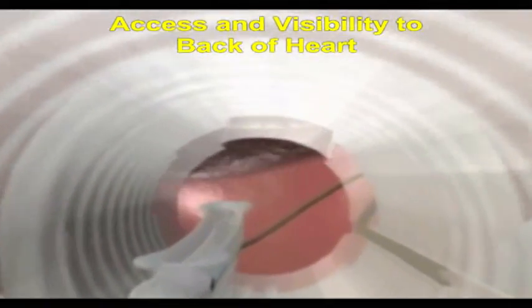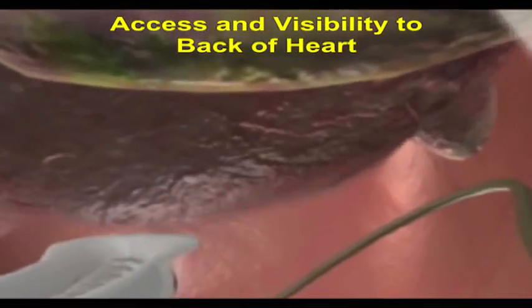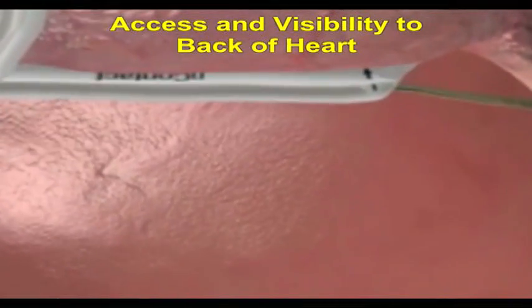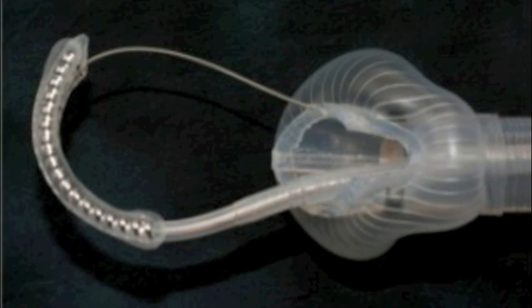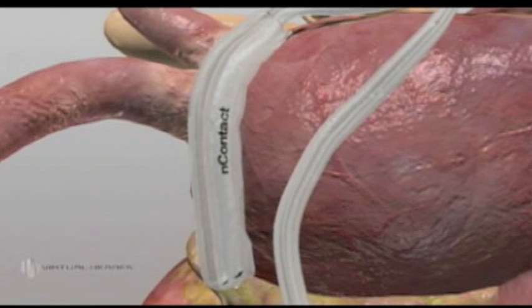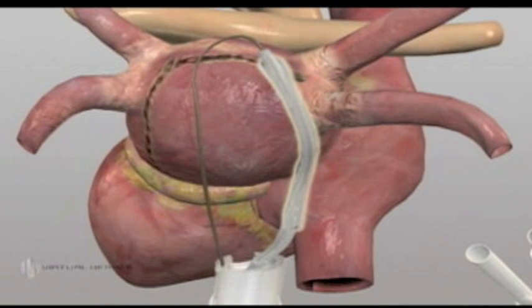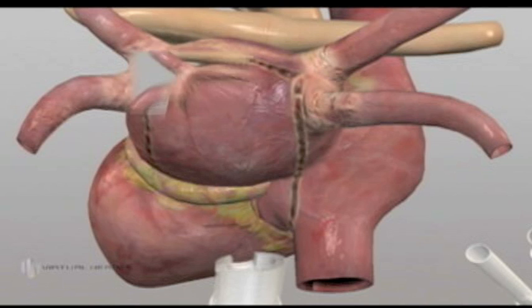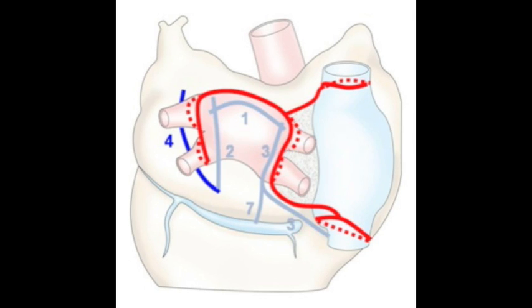The procedure is performed with direct visualization of the beating heart. The specialized electrophysiologic radiofrequency ablation device made by N-Contact is a specialized vacuum device that can be placed by the cardiac surgeon in relevant areas to allow for transmural application and development of scar. The goal is to recreate the classic maze procedure by placing a series of seven burns along pericardial folds.